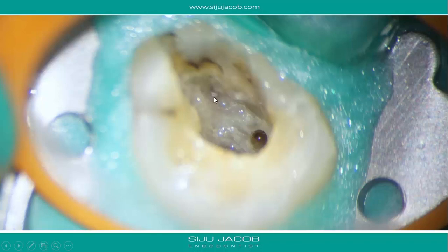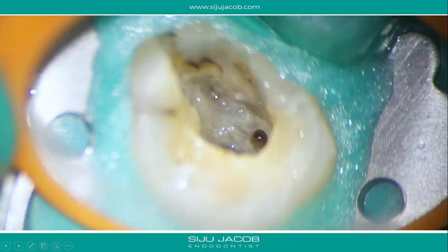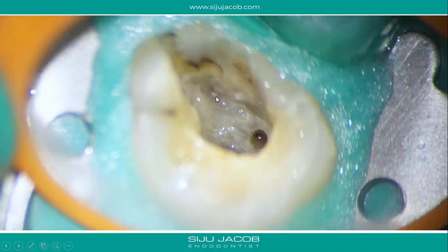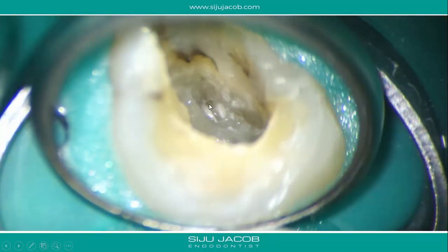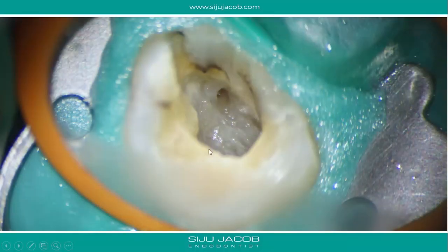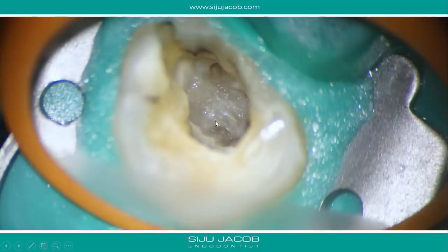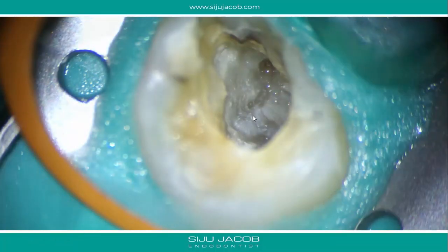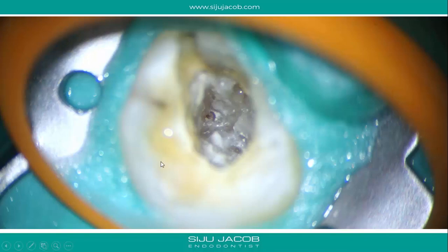We found the mesiobuccal canal by identifying the characteristic white spot, which tells you the tissue is calcified. Once you see a white spot like that, you take a small round bur and precisely drill it out — and sure enough that's where the canal is. Then we looked for the distobuccal and again there was evidence of a white spot, so we drilled that out and sure enough that's where the distobuccal canal was.